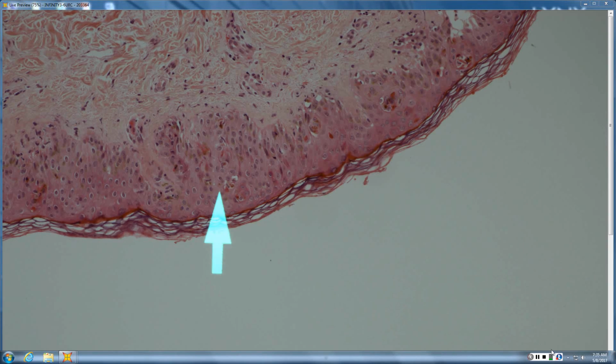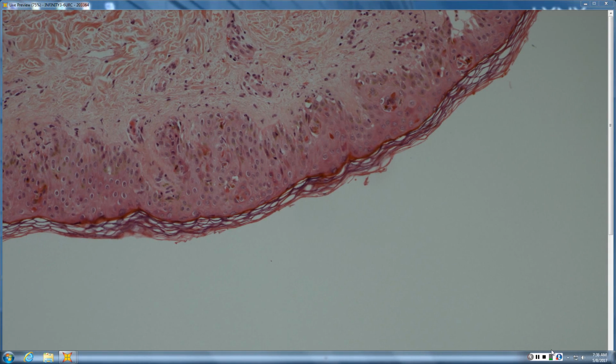Okay, and then all of these guys? So probably erythrocytes, or could be apoptotic keratinocytes. Yeah, exactly. Some are still nucleated. So if that's all apoptotic keratinocytes, then we're talking more about there's a little bit of interface and vacuolization, so maybe more of like an erythema multiforme. Exactly. That's exactly right. Well done.